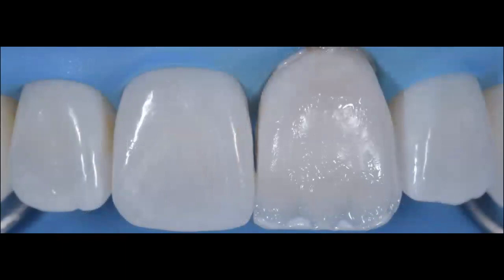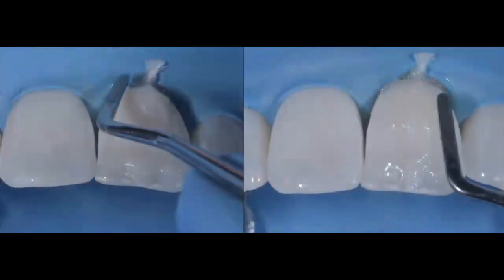Now I've created those mamelons, again using that OBL bleach, that OBL dentin, which is the opaque bleach dentin, and I've created now my 3 mamelons. I've left a little bit of space in between those mamelons so I can add a little bit of blue or a little bit of gray that is part again of that Mirrors 2 kit that is made by Coltene. I've added a little bit of blue there as well so that I can recreate a little bit of that translucent effect that I had on that incisal third.